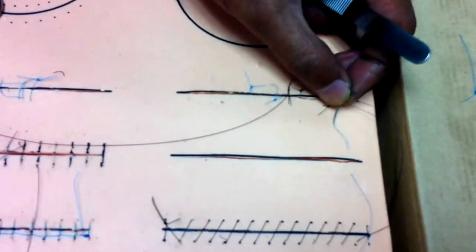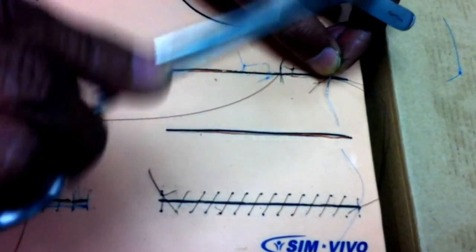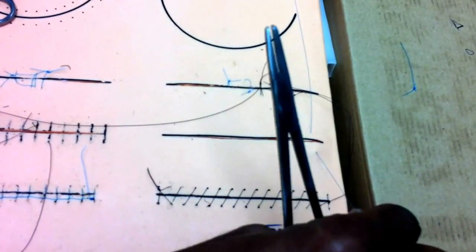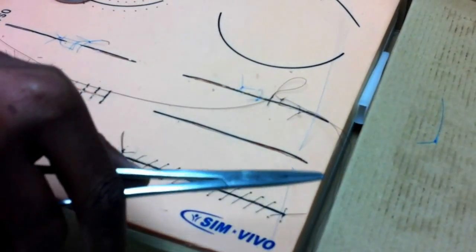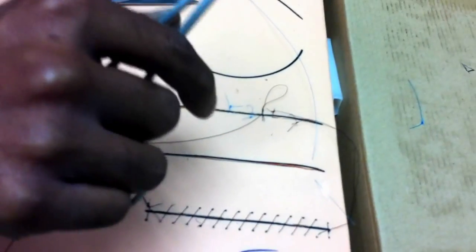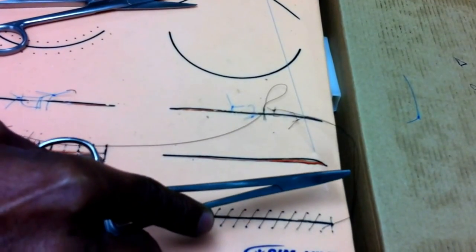Many people try to pull it out straight. That's the wrong technique because the needle is curved, so you have to give it a slight twisting motion so that it follows the curve of the needle. And then with your other hand, hold it and keep on pulling. Make sure that this end is sufficiently small. If you do it like this, then so much is wasted. Believe me, the operating nurse is going to jump at you and say, "Doctor, you're wasting my suture material." So make sure it is of sufficient length.